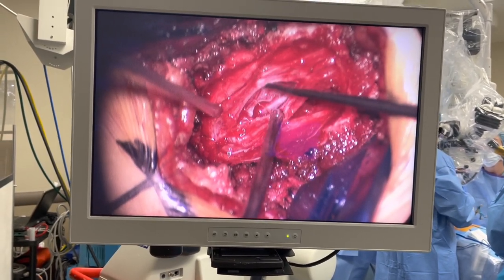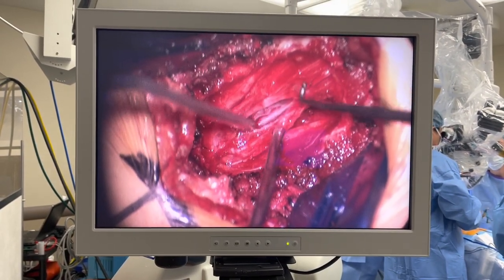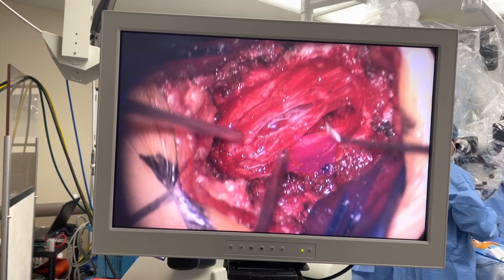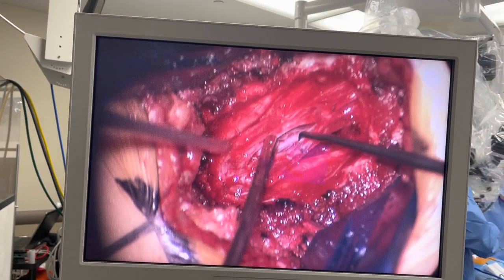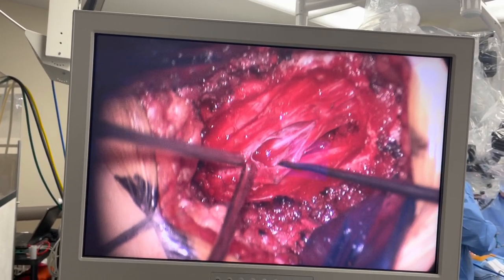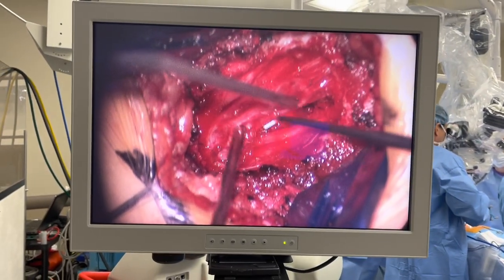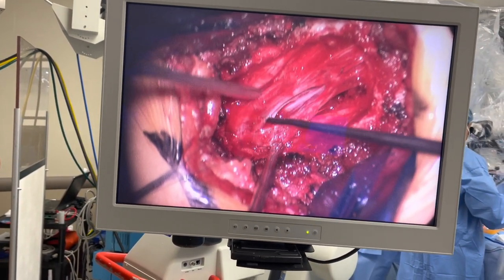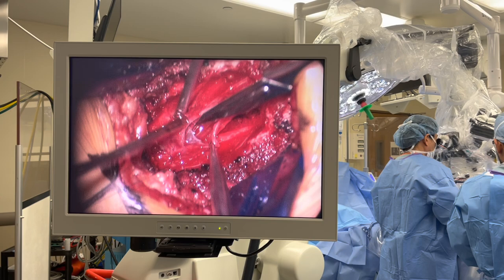Okay, I think I'll be able to imbricate all this right here. All that right there. Oh, yes. God, we got lucky. See that? So all that is clear on that side. This is all clear until we get to right here. Can I have those pickups, please? Put it up more. There you go.